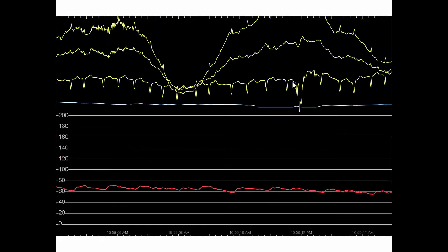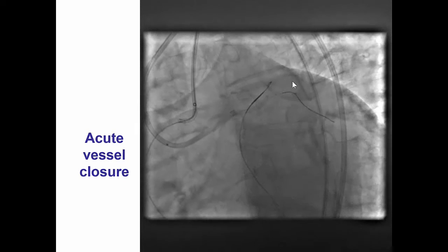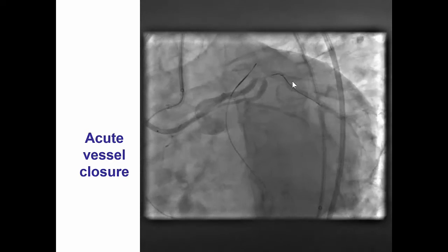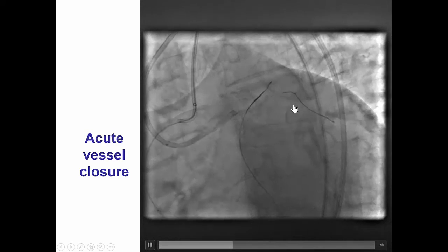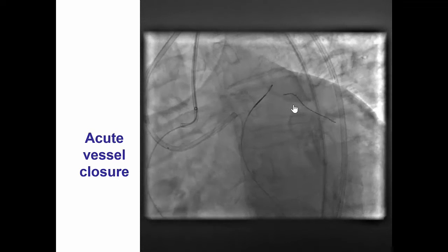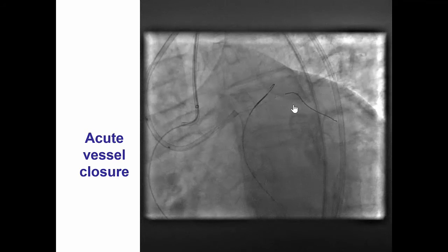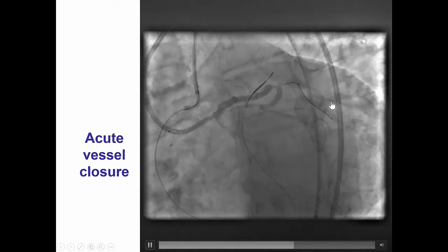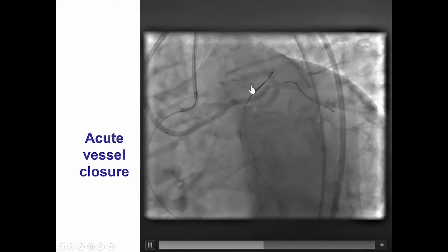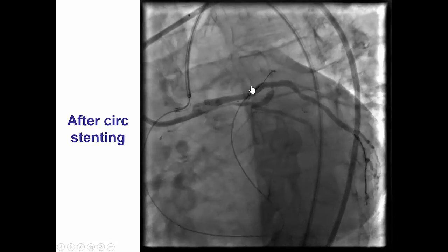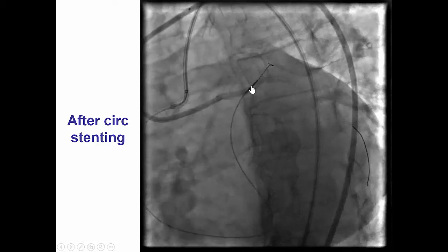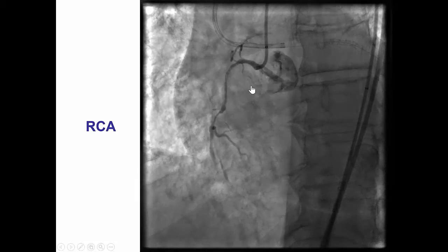However, the patient who was stable shortly thereafter developed chest discomfort and hypotension. You can see the pressure is down to 60 with barely any pulsation. The explanation for this is shown here — there was a dissection into the circumflex causing severe ischemia, given that the LAD was occluded. Fortunately, we had a safety wire into the circumflex from before starting the case, and we were able to place a stent very promptly into the circumflex that restored antegrade flow and helped stabilize the patient.